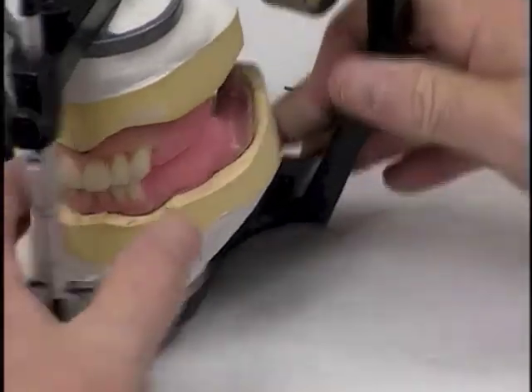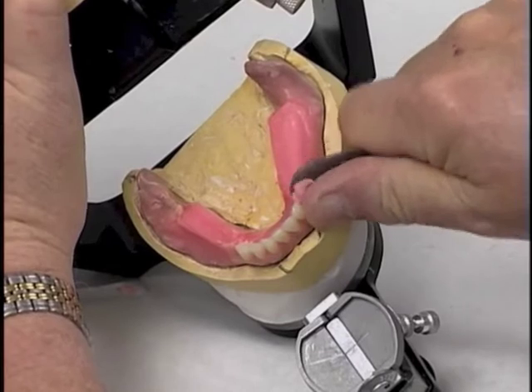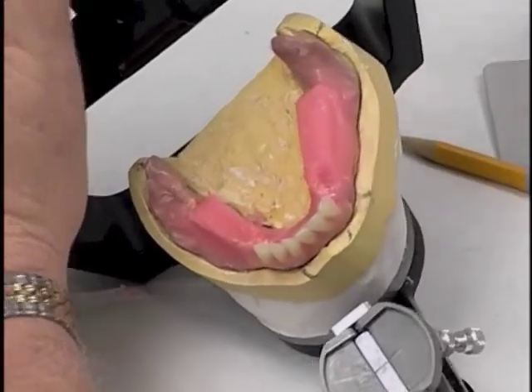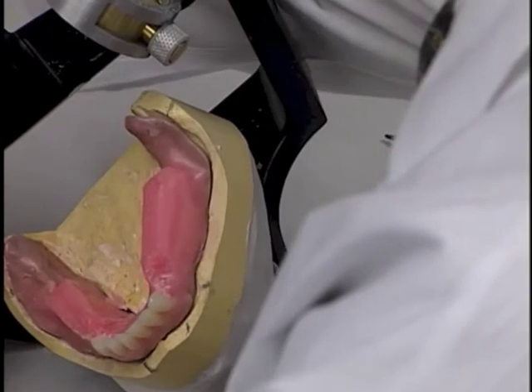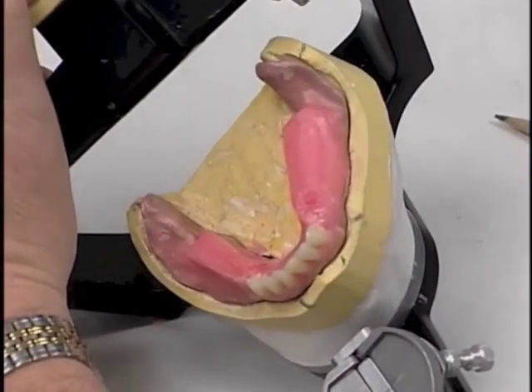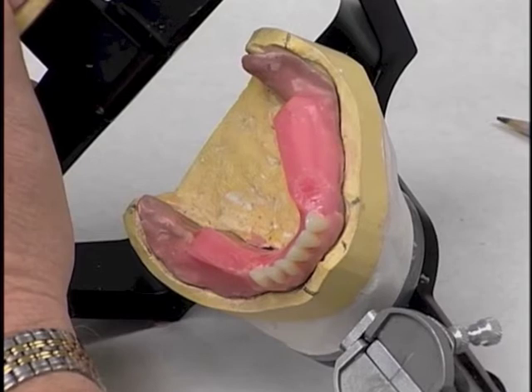So we're going to start the arrangement by removing a wedge of wax from the mandibular first premolar area. And we're going to pull that wax, by pulling the wax in the area where we would like that first premolar.